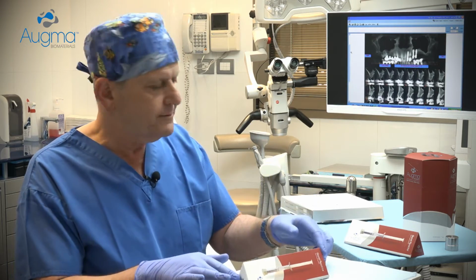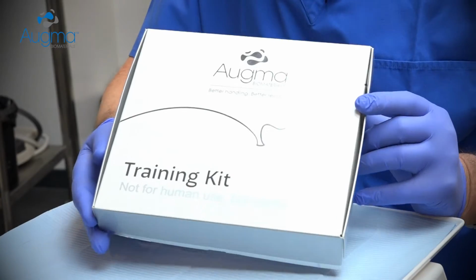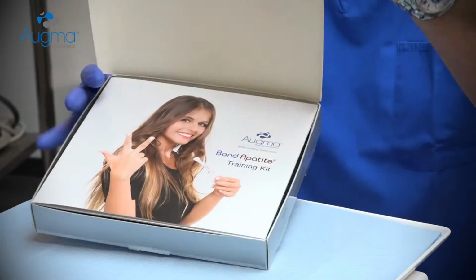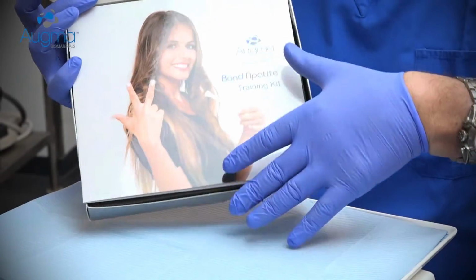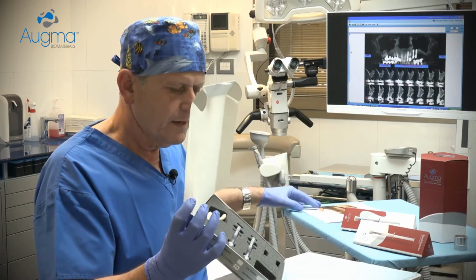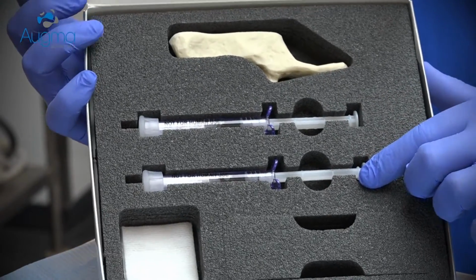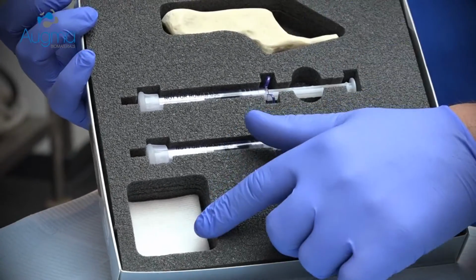So let's get started. In order to be familiar with the material, we provide you a training kit. The training kit includes training manual, 2 demos syringe of Bond Apatite, and mandible and a dry gauze.